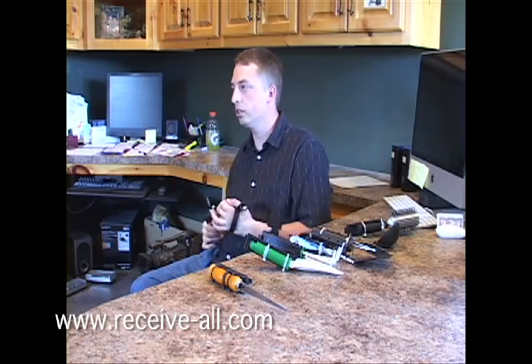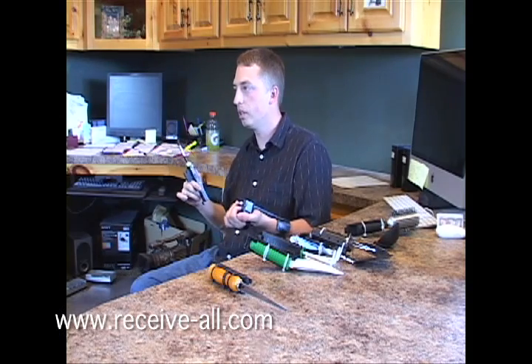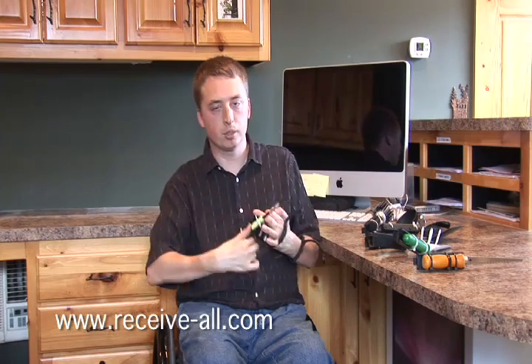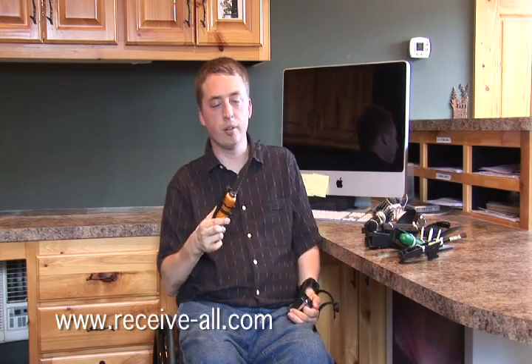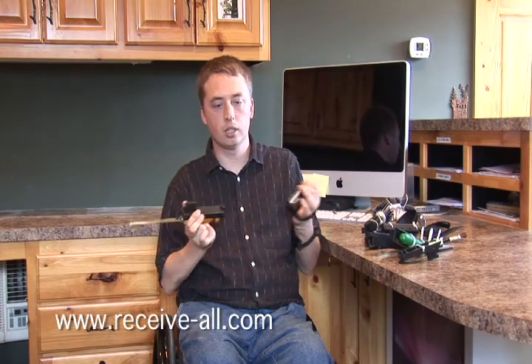Another use we've seen, arts and crafts, just a little paintbrush. Some people have fatigue in their hands, and if they're painting for a long time, they can't hold the paintbrush for a long time. Put it in an adapter, and it's ready to go. Same with this little saw here, similar to a knife. If somebody wants to do some little woodworking with their hands, you put the saw in the adapter, and it's ready to go.